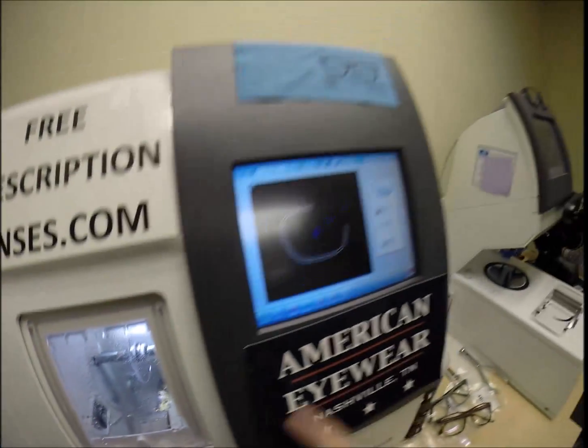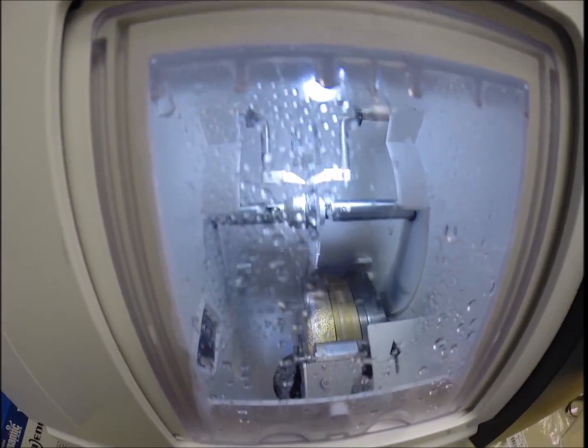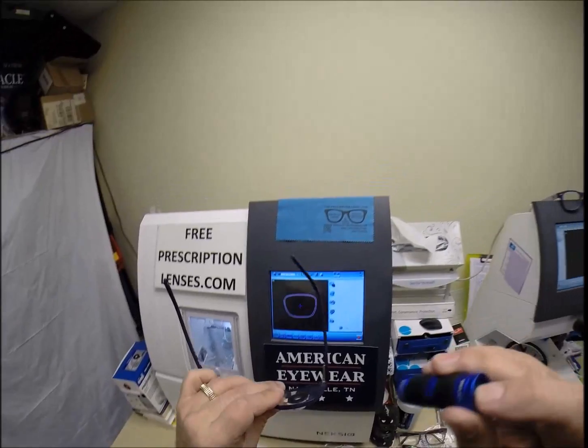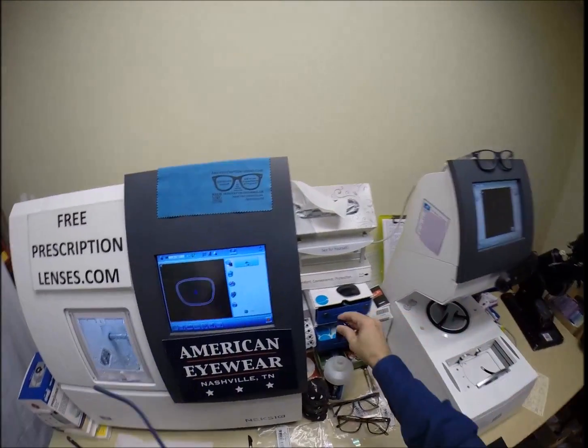The lens is going around tracing the shape of the left side of the frame. And again, measuring, the old carpenter saying measure twice, cut once. It's measuring the thickness of the lens to know exactly where to place the bevel, so you have the least amount of edge thickness showing. And of course, you've got no edge thickness whatsoever in this great American-made frame.